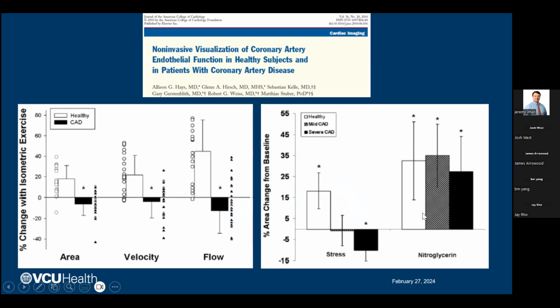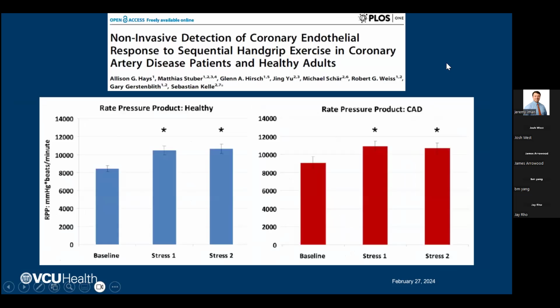So very interesting study. Again, when you have a very focused and quickly decaying response to an exercise challenge like this, it lends itself very well to repeated imaging in the same session with some sort of quick intervention like nitroglycerin or whatever drug you're choosing, as long as it has a rapid onset, to test some very interesting hypotheses.